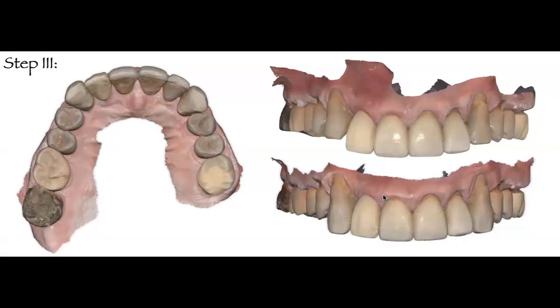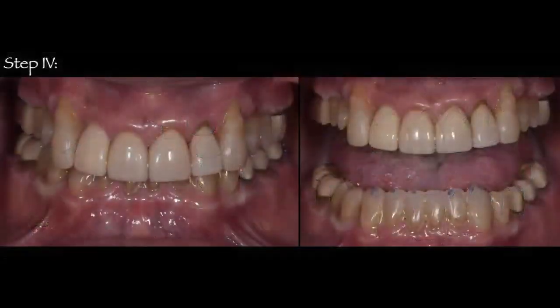So this is how this prototype worked on the lower and the upper teeth, and you can see now my full prototypes on the maxillary incisors, lingual surfaces, and the canines, and the same on the mandibular incisors and canines. And you can also see how I was able to establish centric stops and canine guidance because I don't have any tooth on the back interfering with this new segmented increase in the vertical dimension.